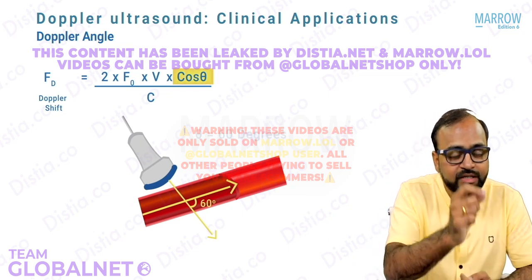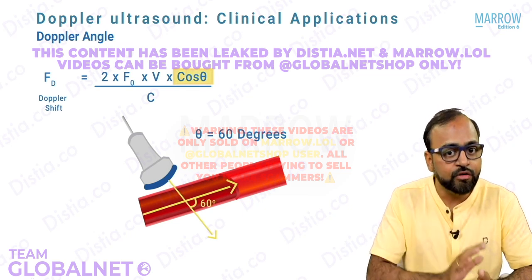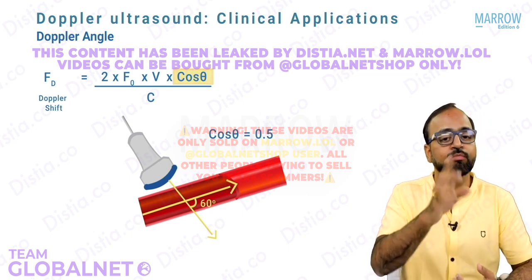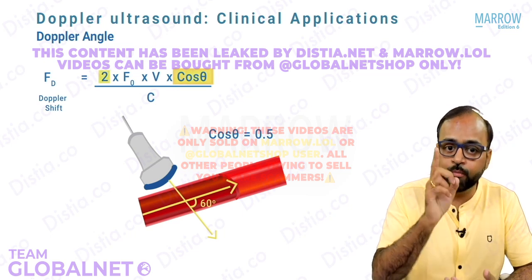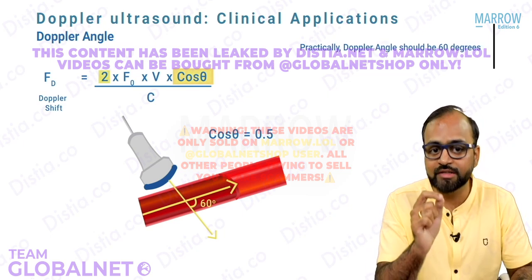So if theta is 60 degrees, that is, the Doppler angle between the ultrasound beam and the plane of blood flow is 60 degrees, cos of theta becomes 0.5. Do you see in the numerator in the Doppler equation there is a 2? 0.5 multiplied by 2 will become 1, and therefore we must try and keep the Doppler angle always around 60 degrees.